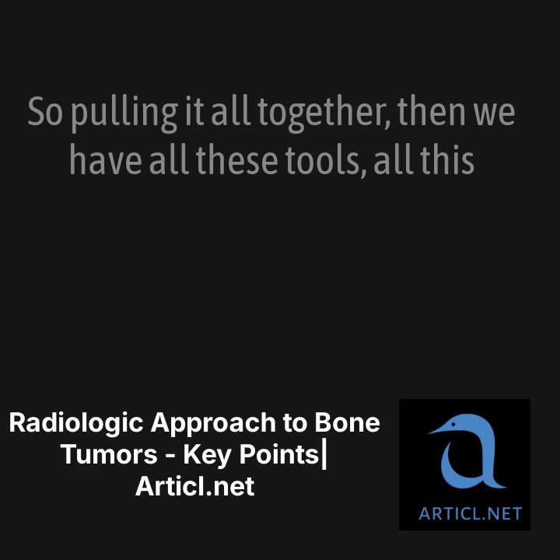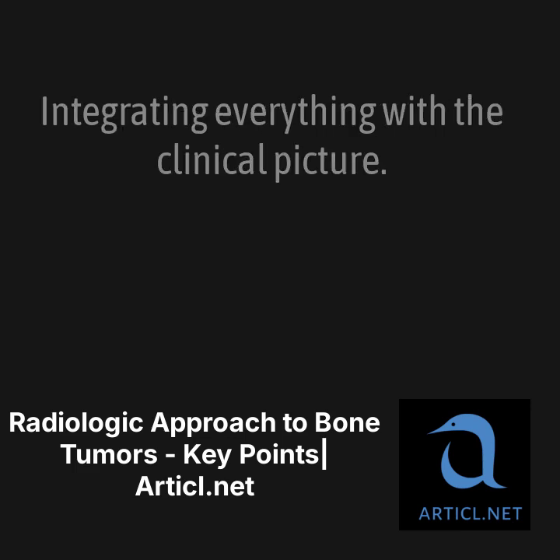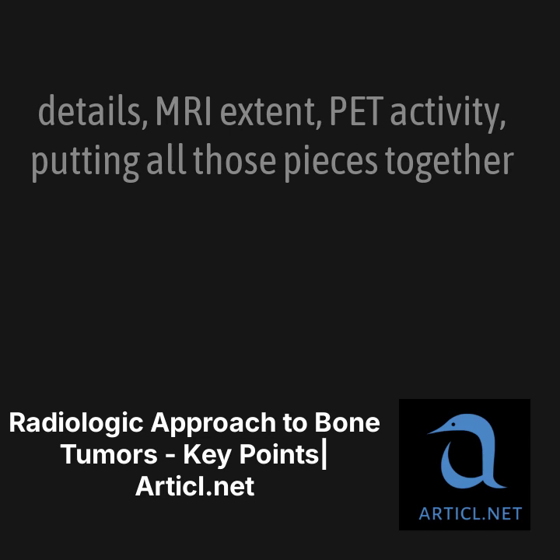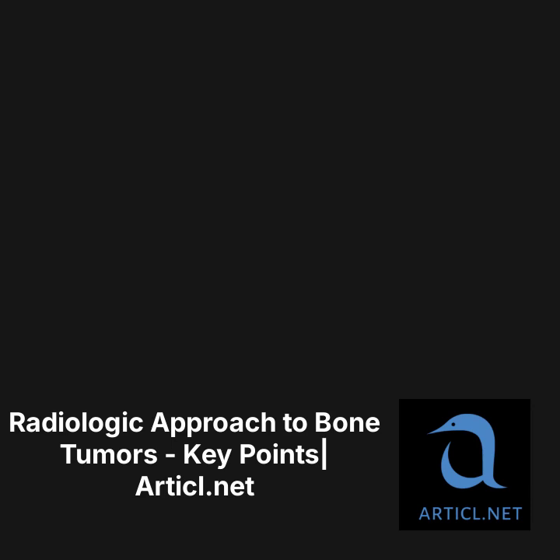So pulling it all together then. We have all these tools, all this information. The real skill is synthesizing it, isn't it? Integrating everything with the clinical picture. That's exactly it. Our role is to build that coherent diagnostic story. It's this layered process: age, location, plain film pattern, CT details, MRI extent, PET activity, putting all those pieces together to stratify the risk. Guiding those crucial next steps.